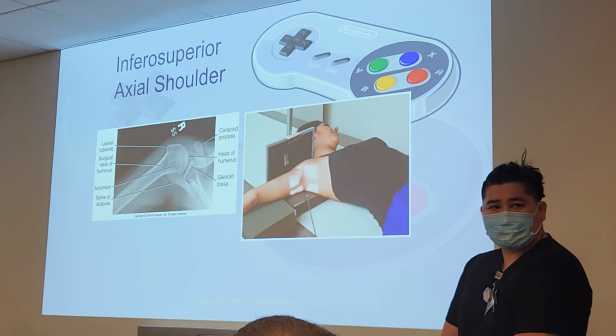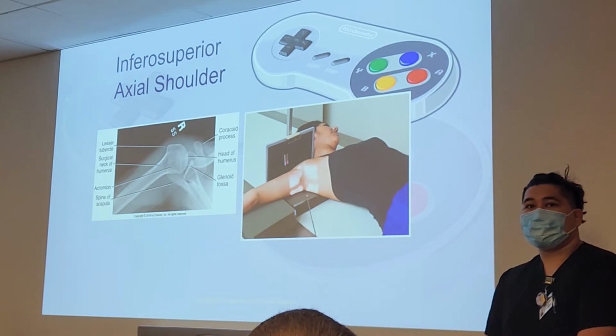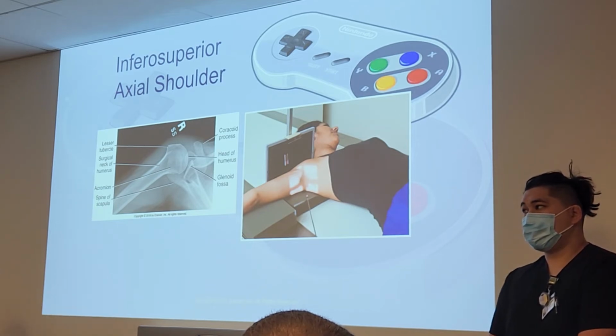You said this is a trauma view? This is a trauma view, yes. So if somebody dislocated the shoulder, can they raise their arm like this, laying down? Maybe yes, maybe no, you kind of have to shoot as they lie, but you can still get that view even if their arm's kind of just neutral. Still shoot through the armpit.